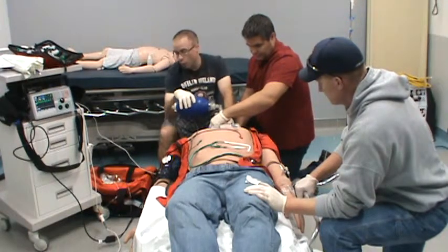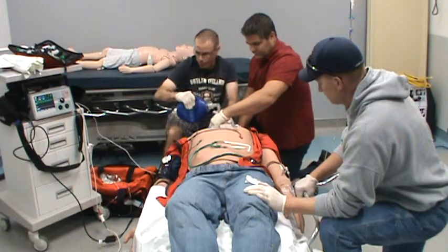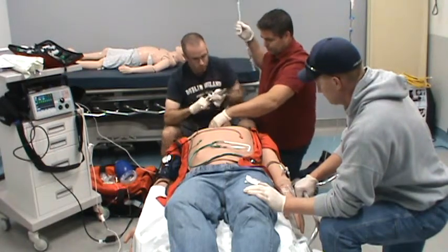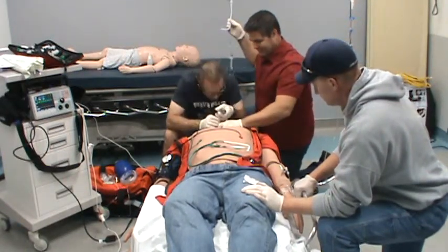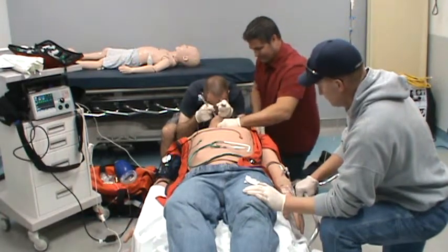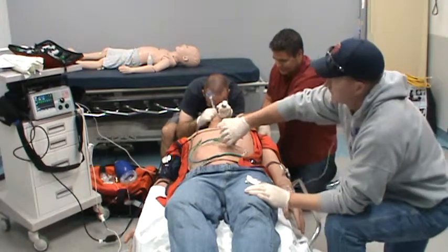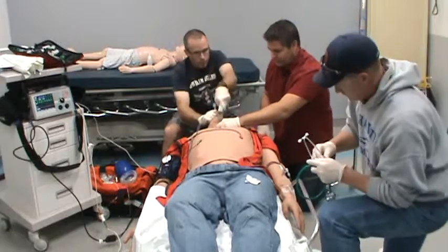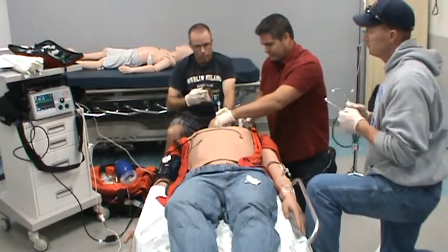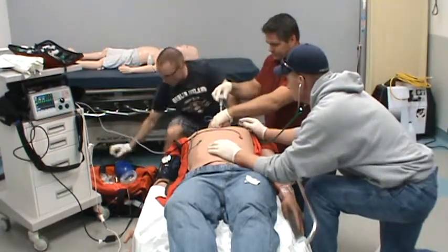We have the end tidal out, ready to go. It's right here. Fasciculations have stopped. Okay, and the tube. I see the cords. You see the tube passing the cords. Okay, and we are at 24 at the teeth. Inflate the balloon, and Rob, if you can take a listen for me here.